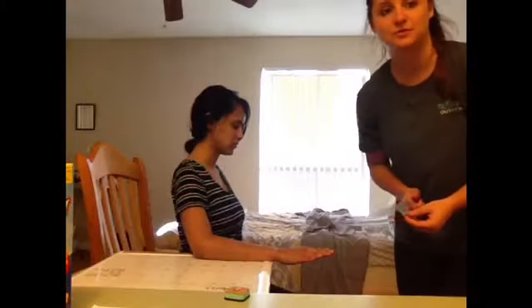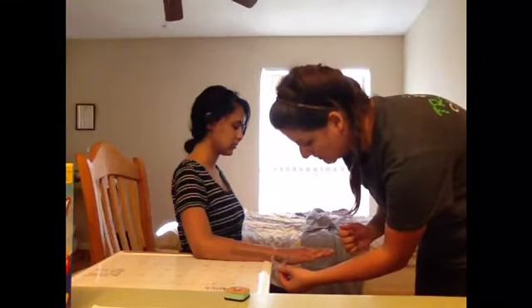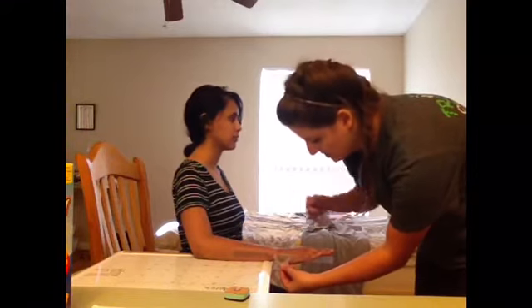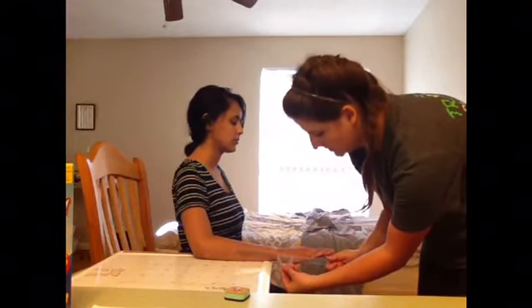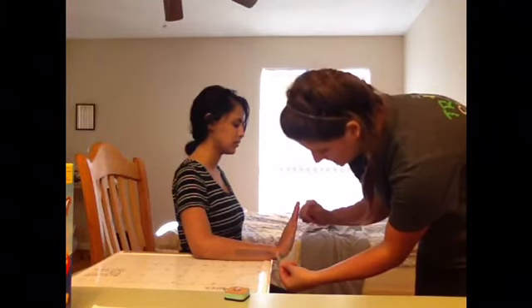This is range of motion for wrist extension. The axis is going to be over the lateral aspect of the wrist over the triquetrum. The stationary arm is the midline of the ulna, and the mobile arm is the midline of the 5th metacarpal. You go into wrist extension. 60 degrees.